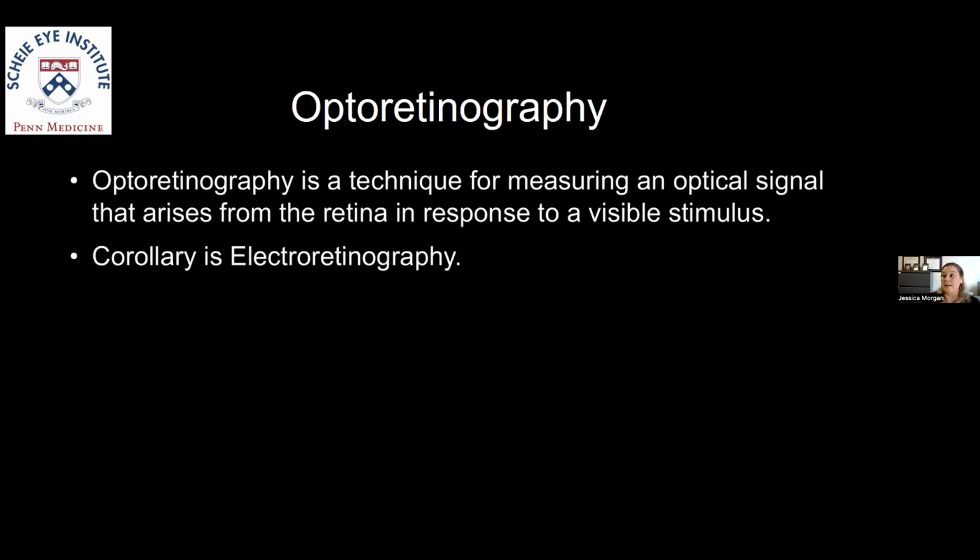So I really enjoy the adaptive optics microperimetry. It's fun to me to be both the testee and the tester. I've sat on both sides of that experimental protocol. But in all honesty, it's tedious, it's slow, it requires a lot of concentration, and the required methods for zeroing in on a threshold at each of those small spots, even within a small region of the retina, really means that it's not going to be a high throughput method for either a large number of spots or a large number of patients. You really need to direct your experimental design to make sure that you're testing to answer very specific questions about the condition that you're looking at.